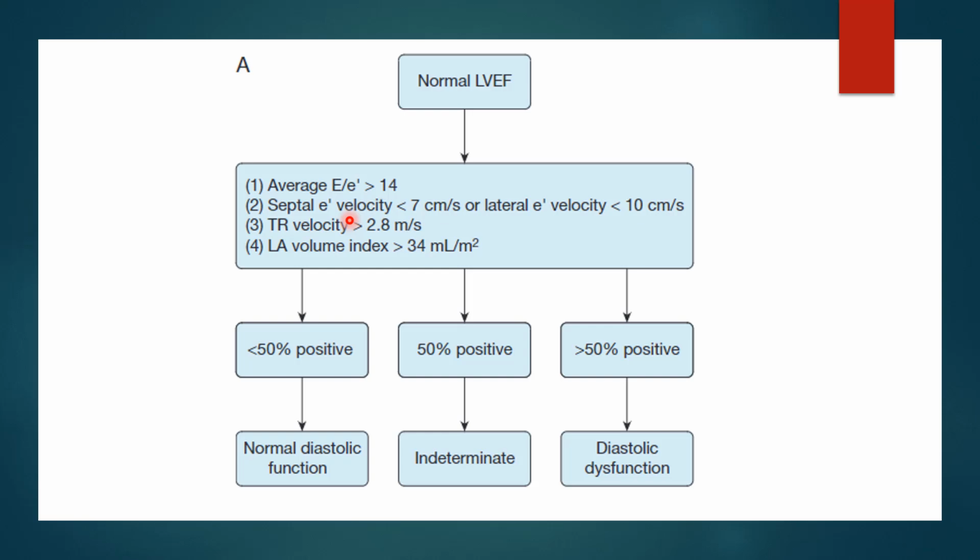Paul Mayo in a critical care diastology paper. You can use 8 or you can use 7, but as intensivists, we're trying to look for extreme examples. So if it's less than 8, I would be concerned for impaired relaxation. Now, the TR velocity probably tells you a little bit about chronicity, and whether this diastology is impressive enough and significant enough to cause pulmonary hypertension.